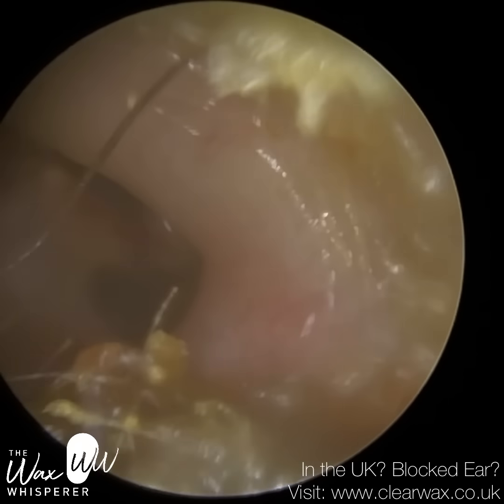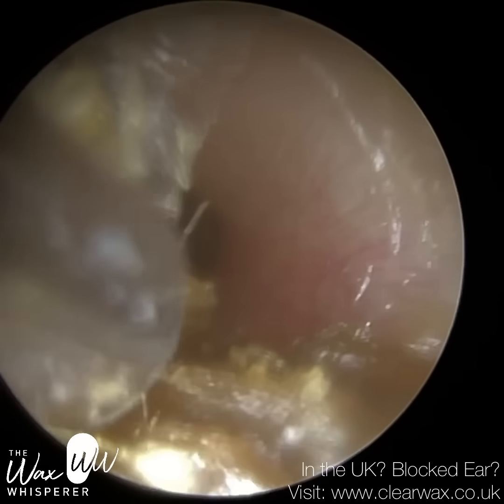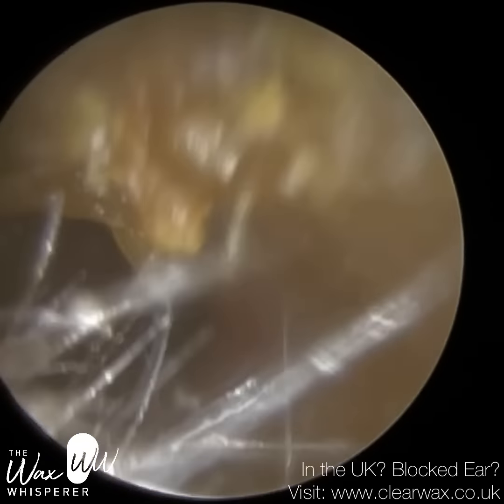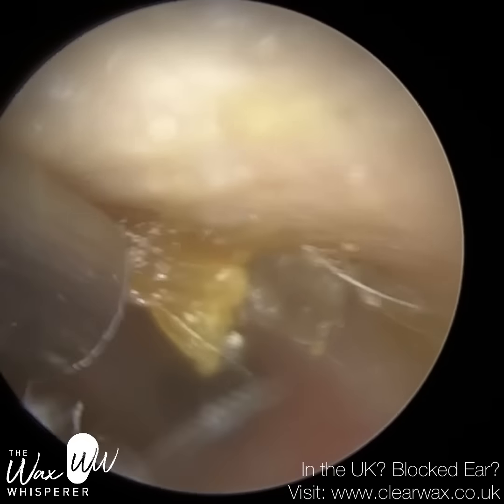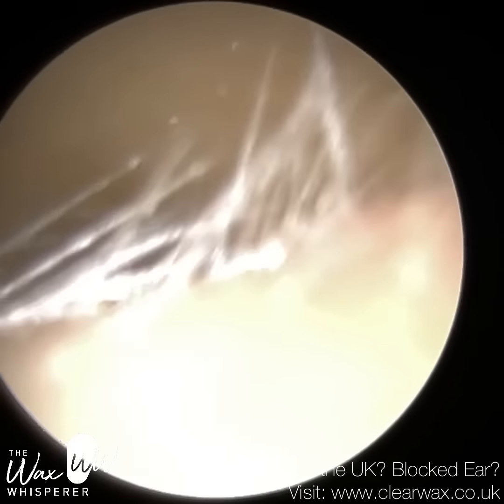So the left ear's done. We're just doing the right ear now. I would say this is semi-occluding. Once again, there is earwax, but also a higher concentration of dead skin keratin. And I'm just using the endoscope to stretch the ear open. You can see the eardrum already in the distance. I think I've reverted to a fine end suction probe.